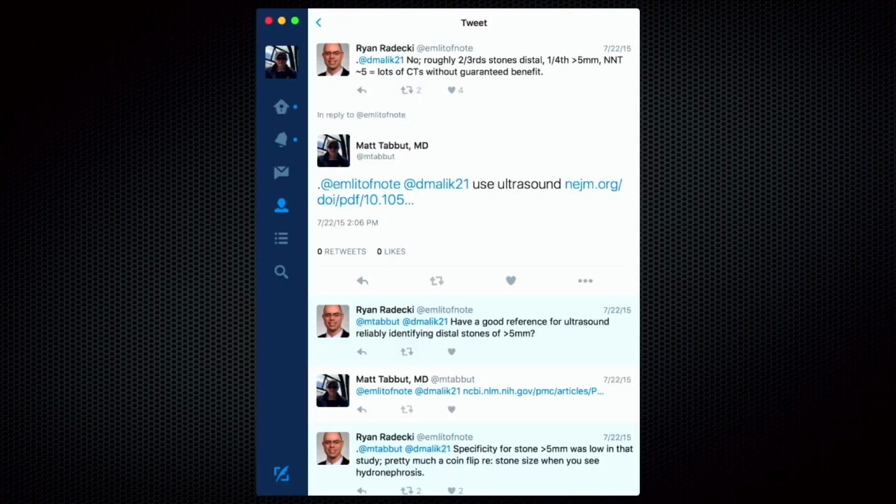And we kind of got started on this conversation years and years ago with a Twitter conversation that I had with the guy who runs EM Lit of Note. And he was basically just pressing in and saying, hey, what's the literature for ultrasound-guided evaluation of kidney stones? And right, there's some good literature that says, hey, look, it's safe to do, right? You don't have this huge missed bad outcome phenomenon.